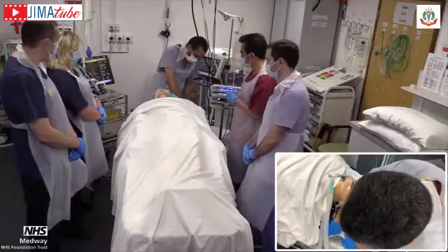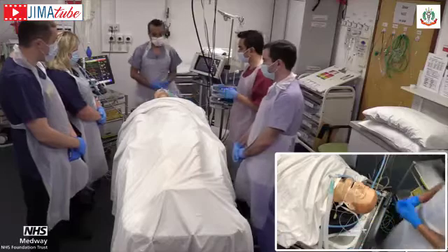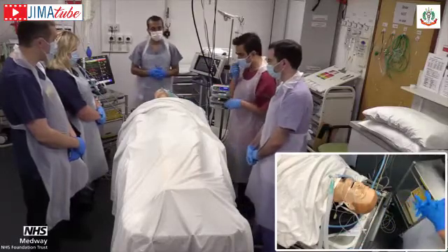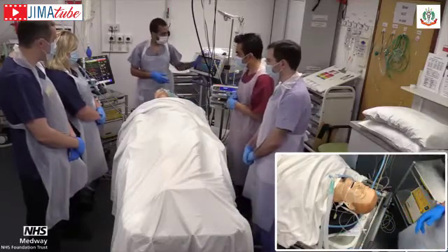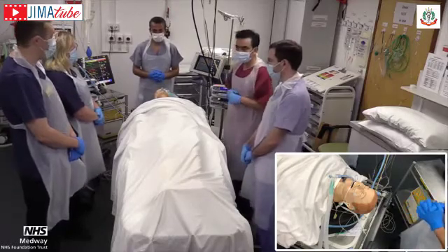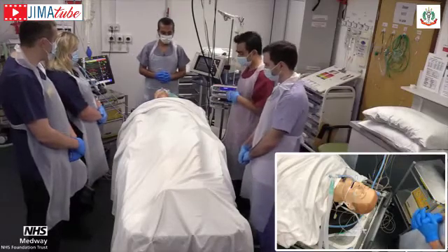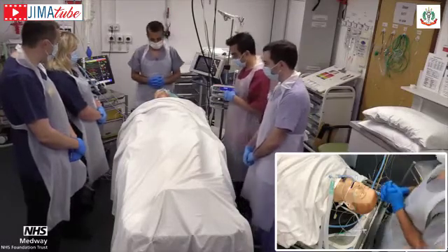This patient was not absorbing well, therefore he was on free drainage through his NG tube, but often patients will be on continuous feeding, and it can again be safely detached after aspiration. So are you all ready? We are all happy with what we have got. Okay, so we will go with Vipul's call.